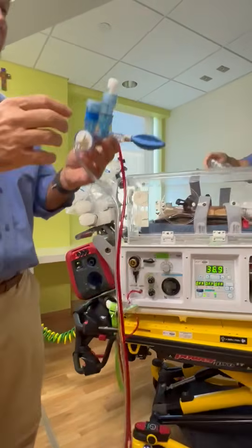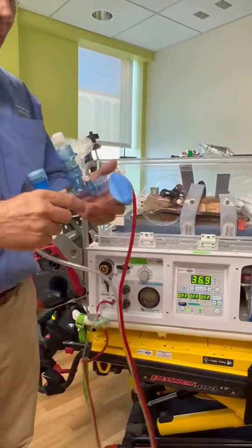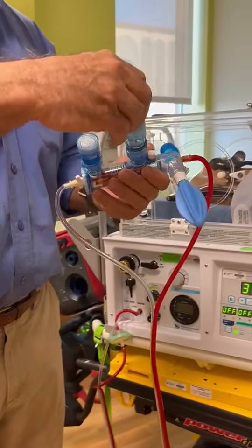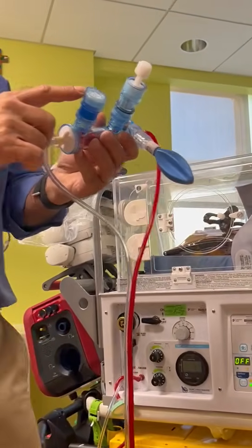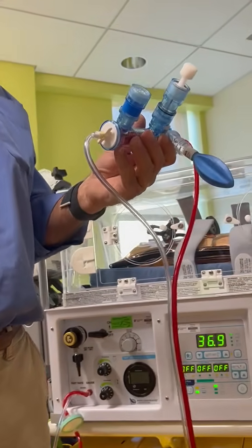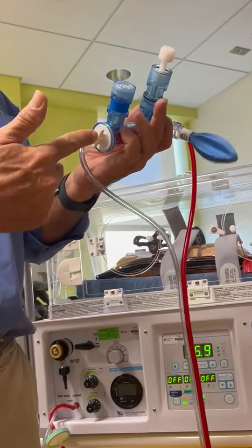My left hand's phasitron, and then I'm just going to go through it piece by piece. So this is the E-tube, where our pressure circuit's going to hook up. This is the mean airway pressure knob, so I'm assuming y'all dial it all the way back out, right? Okay, and this is, I don't know what y'all call this, entrainment port? Yep. And I think of it more like an equalization port because it's always trying to equalize to outside atmospheric pressure. And then this is just our inspiratory limb.